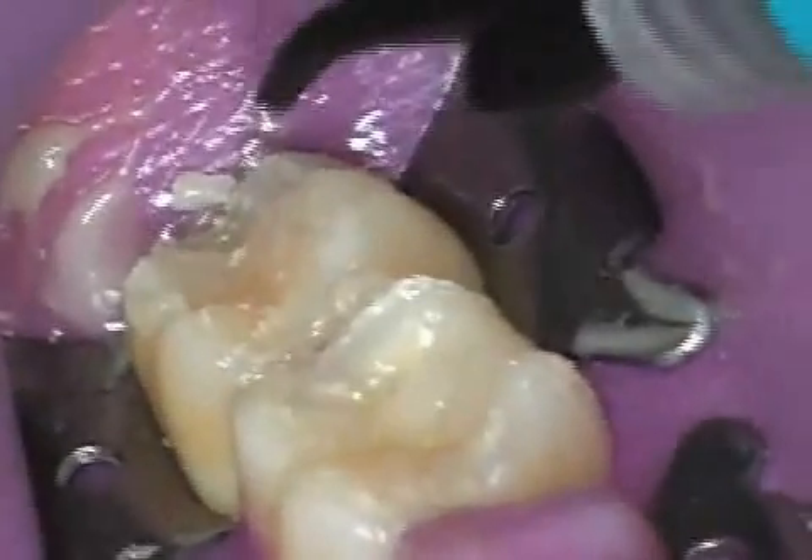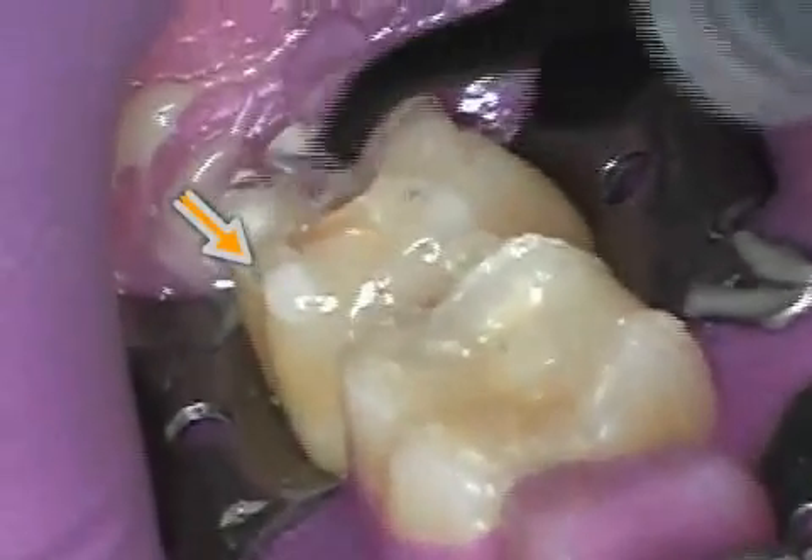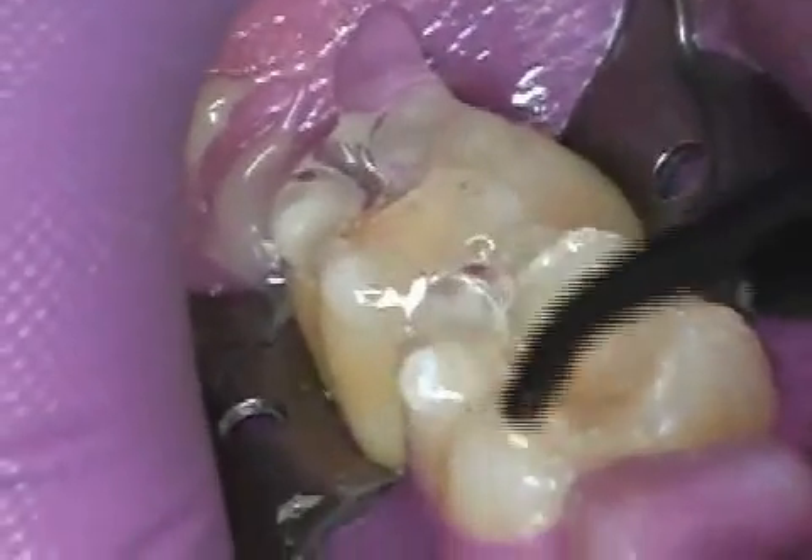After initially hardening the glue quickly with a heat lamp, the surplus glue is removed. This is still easily done because the glue's interior is still soft. Now Air Block is applied before the final hardening — the transparent gel. Only this step enables the glue to completely harden.